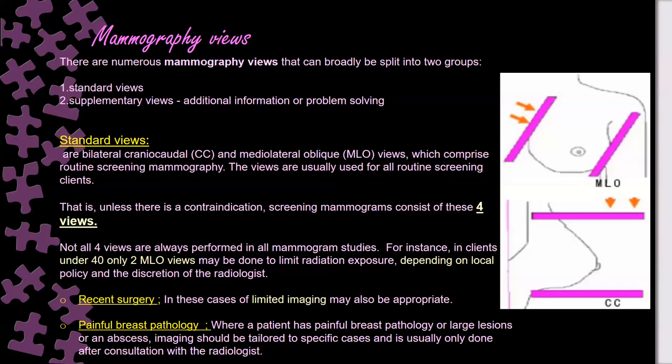Okay, so as we mentioned, either we have the standard MLO and CC view. These are four views, usually performed in both screening and diagnostic views, but sometimes we might do fewer than these four views, in which case?